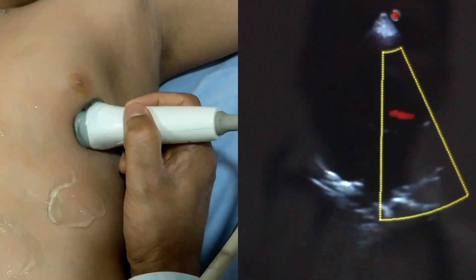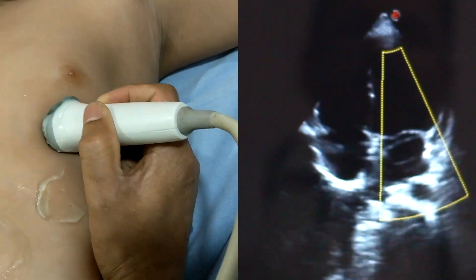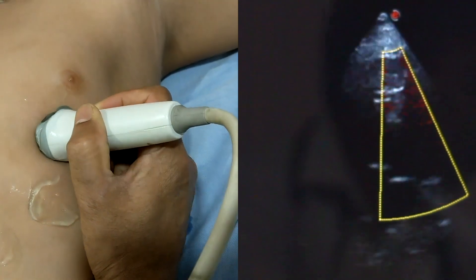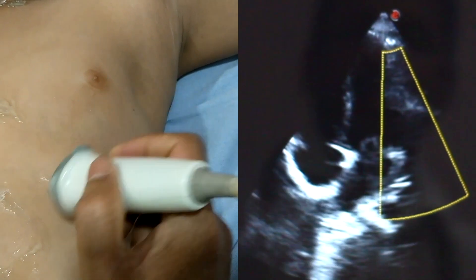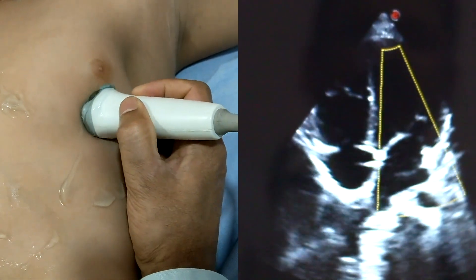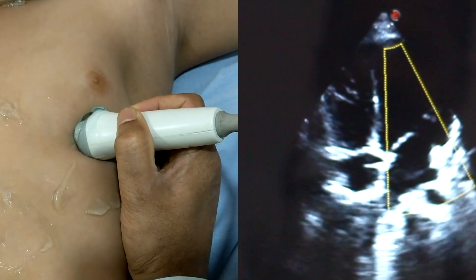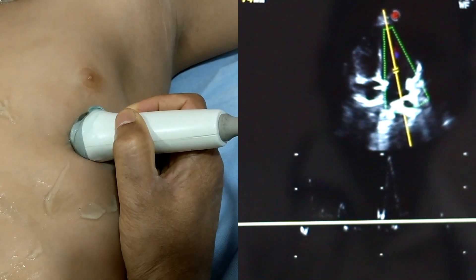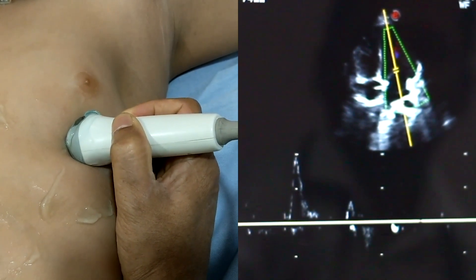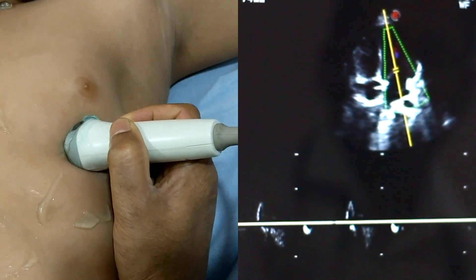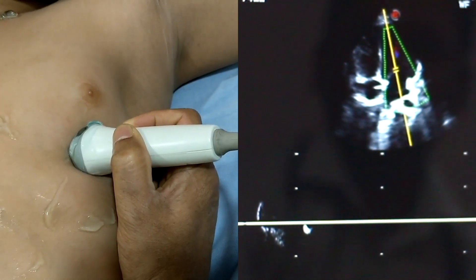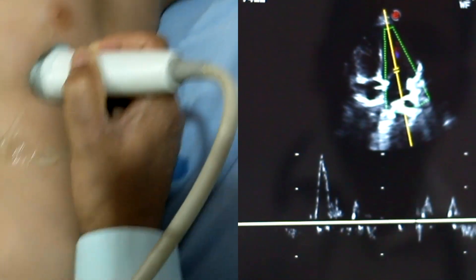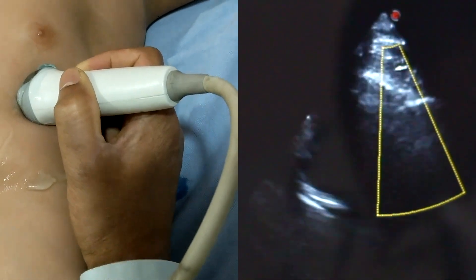Tilting the probe is important to get maximum resolution and accurate ultrasound images. I am firmly touching the skin while tilting and holding the probe. This is the pulse wave Doppler of mitral flow. Here you can very clearly see the E-wave and A-wave. This is the mitral flow pulse wave Doppler.